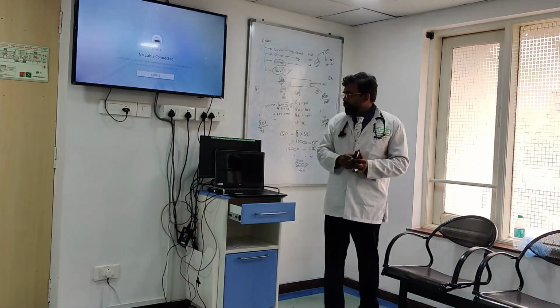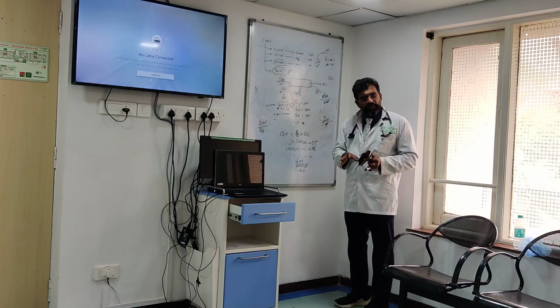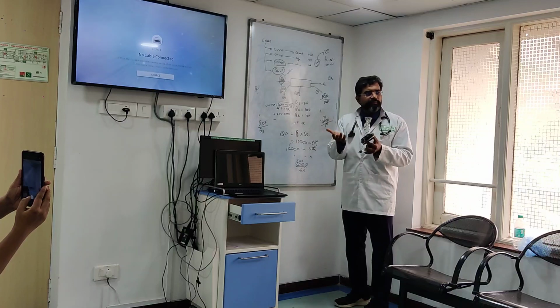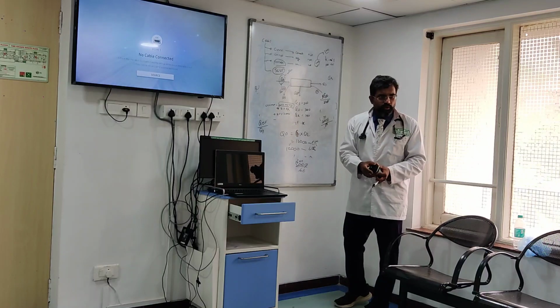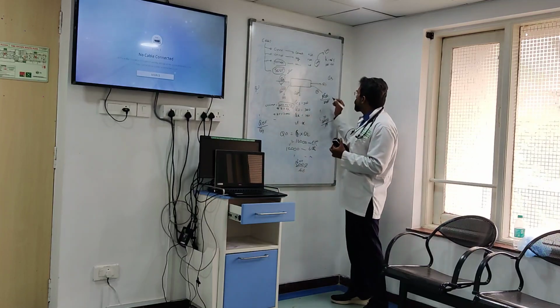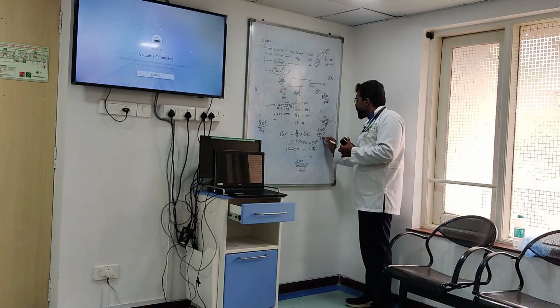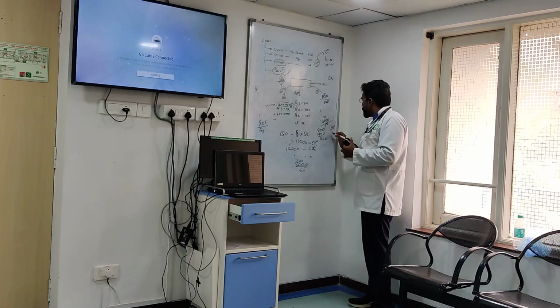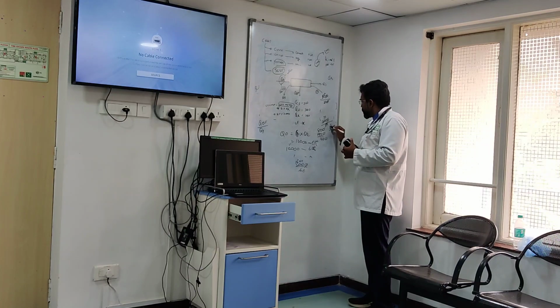You understood? Now you were asking, how am I determining this? It depends on my dose. I want to give 35 ml per kilogram per hour. That is the dose I want to give. So I am going retrospectively, what I want, which part of the therapy I want. Do I want convection? Do I want diffusion? Do I want UF? Based on that I am taking my entire call. Okay, you understand? So conventionally starting point 800 बोलिए चलो, because 25 ml per kilogram अगर पकड़ा मैंने 25 ml, so say 800 plus 800 is 1,600. Now 1,600 if I divide by weight of say 50 kilos, कितना आता है ये? 33.